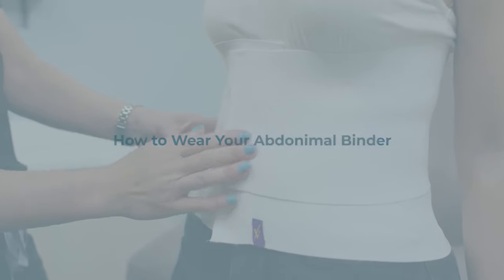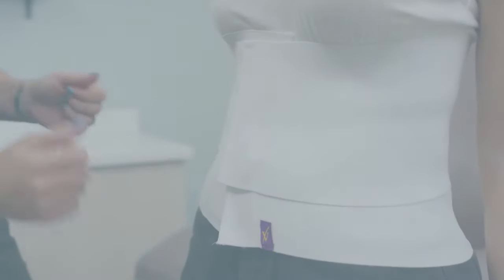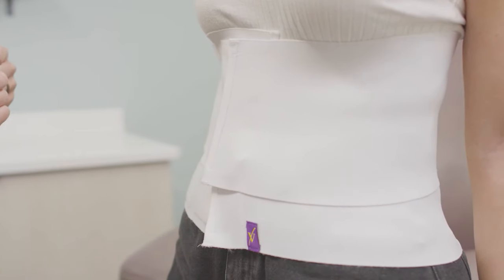This video is intended to give you all the instructions you need for the use of your post-surgery abdominal binder. Abdominal binders are used to achieve compression around the surgical site.